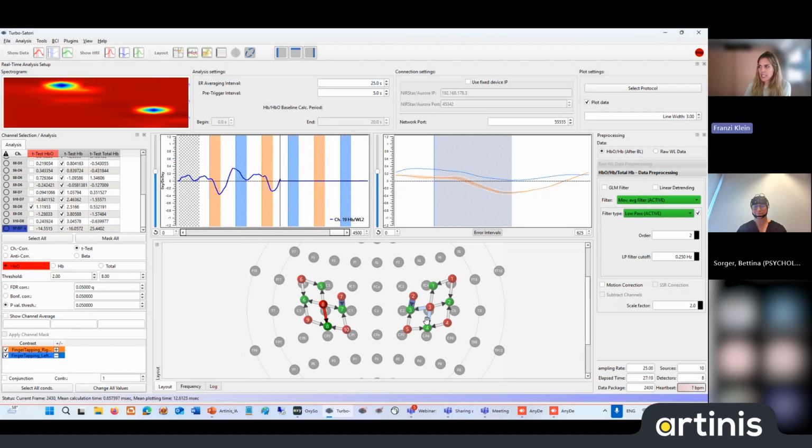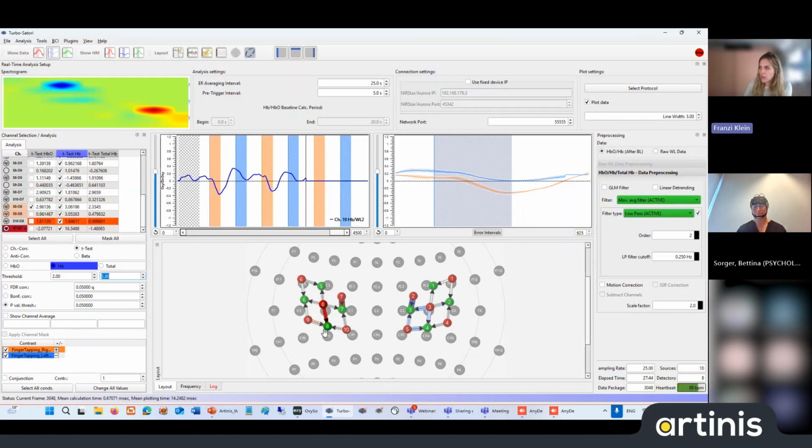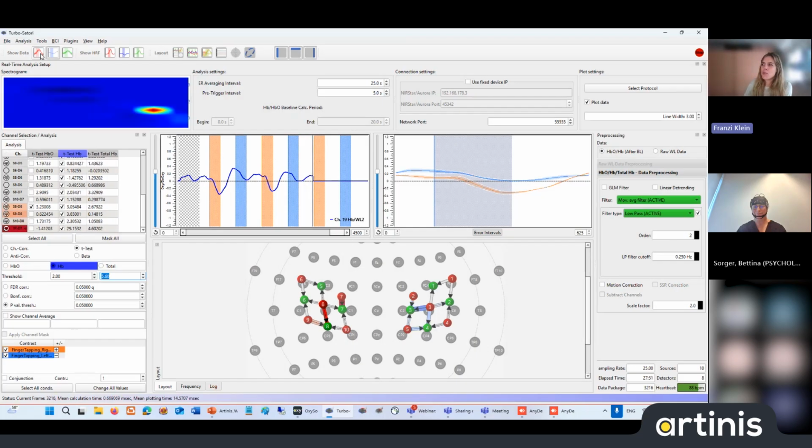So now you can see here the T values for each of the channels, and for this threshold range. And since it's HBO, I switch to HBR. And what we usually would expect, as she has shown before, is that we have a stronger activation here on this hemisphere, which is not really happening. Yeah, usually the case for demonstration purposes.